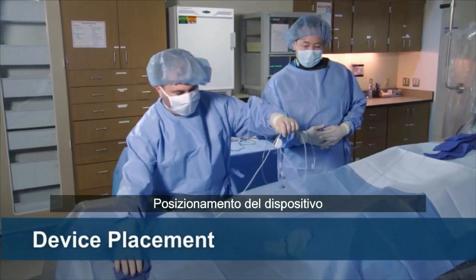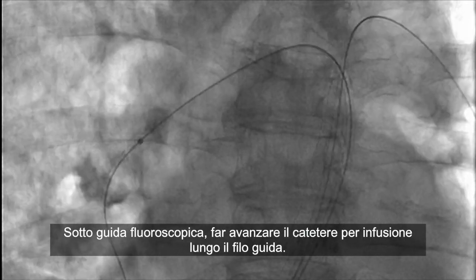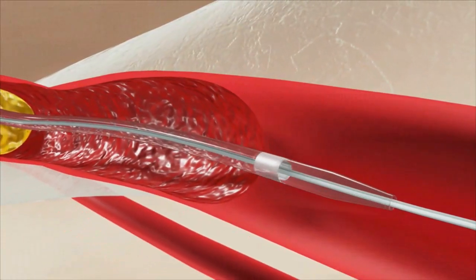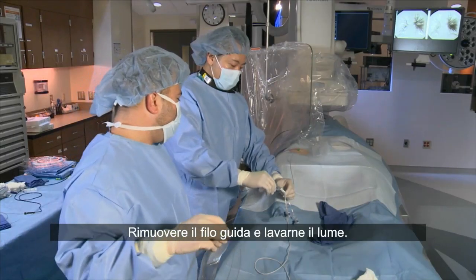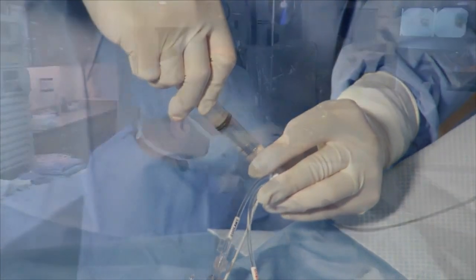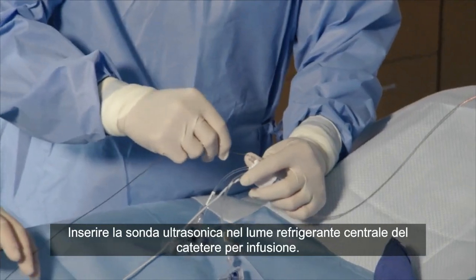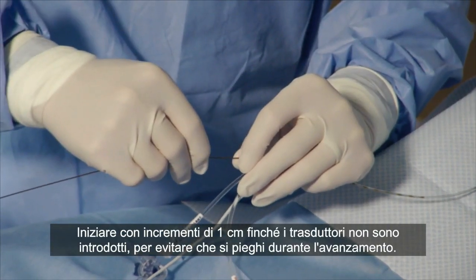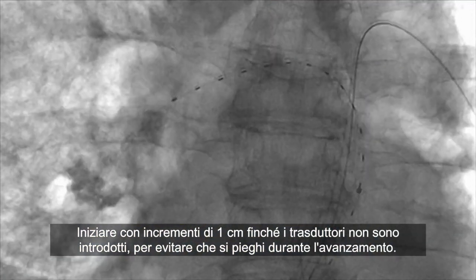Device placement. Using fluoroscopic guidance, advance the infusion catheter over the guide wire. Remove the guide wire and flush the guide wire lumen. Insert the ultrasonic core into the central coolant lumen of the infusion catheter. Start with 1 centimeter increments until transducers are introduced to avoid kinking during advancement.